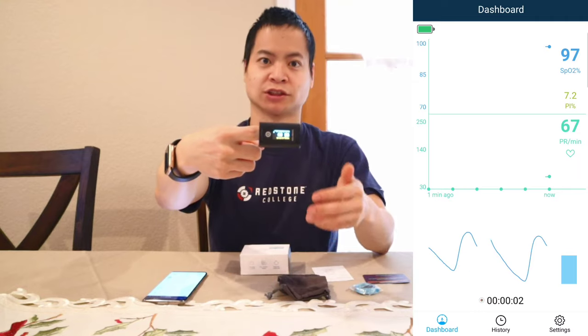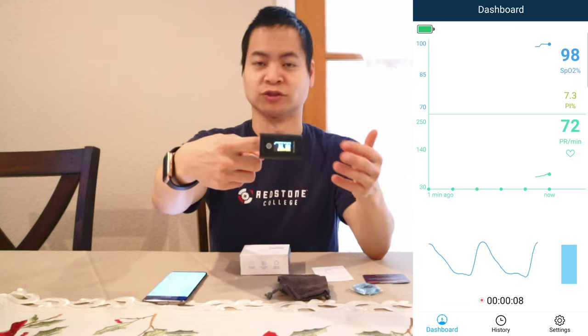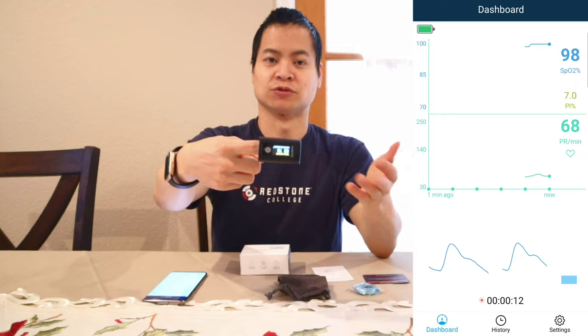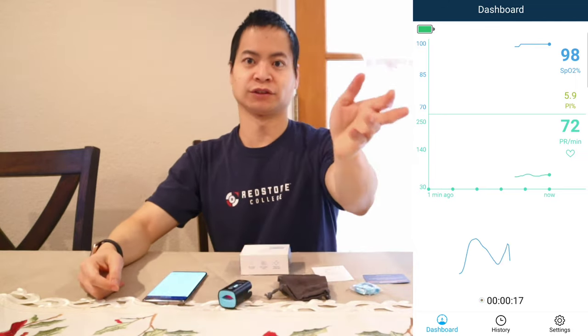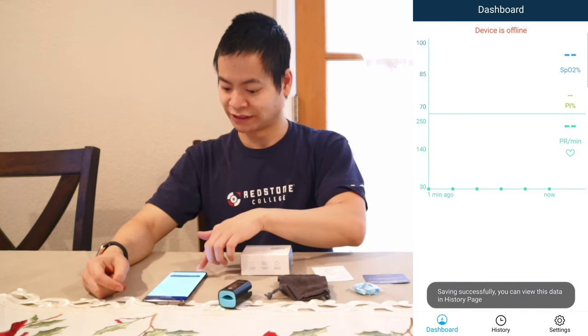As you can see, I'm at 97%, so I'm within the normal range, and also at about 74 beats per minute resting heart rate — I haven't been moving a lot for this filming, but that's basically my resting heart rate. And once it's done, all you do is take it off your finger, and within a few seconds the app will save that entry. You can see it says 'saving successfully — you can view the data in the history page.' So let's check out history — we got an entry. I've done three other entries and you can see my statistics, including a little graph over time and my heart rate as well.